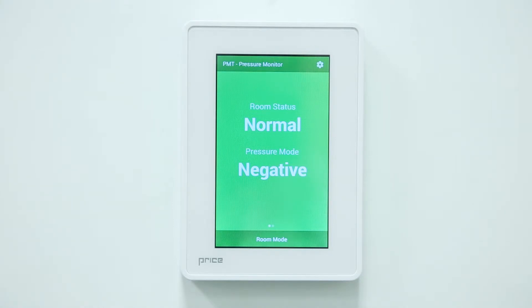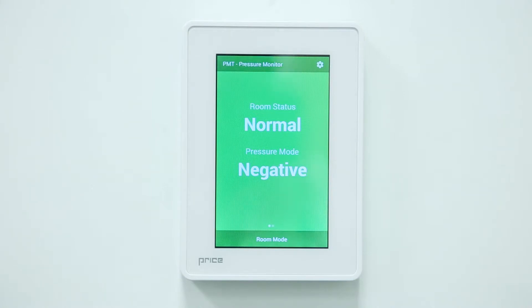The PMT can be set to a setback or unoccupied mode which will deactivate the alarms. When in setback mode, the PMT will turn blue. This is the typical room mode when the room is not in use or not in critical use.